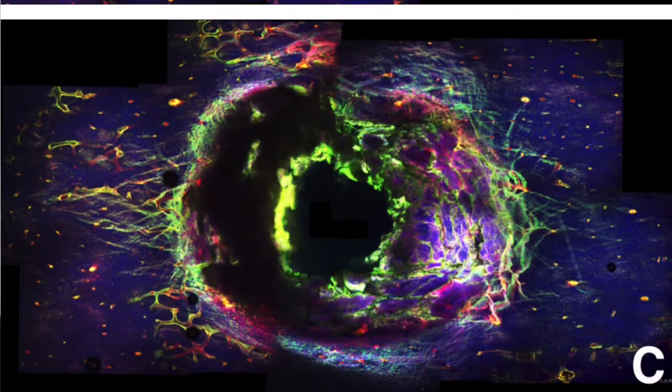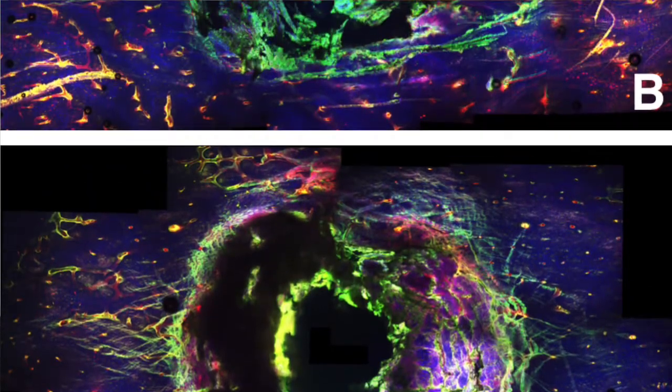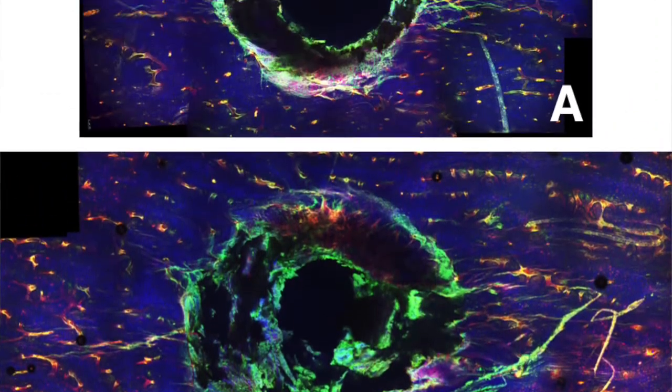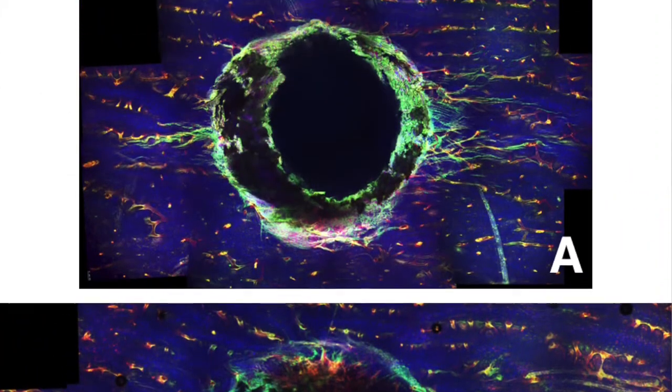The increase in number of threads embedded into the bone would undoubtedly equate to an increase in microdamage, as the bone is displaced by the cutting characteristics of the thread. The greater amount of microdamage associated with 2 millimeter thick bone biologically might equate to an extensive remodeling region adjacent to the orthodontic miniscrew. To reduce the amount of microdamage and achieve complete insertion, a pre-drill protocol is advocated.